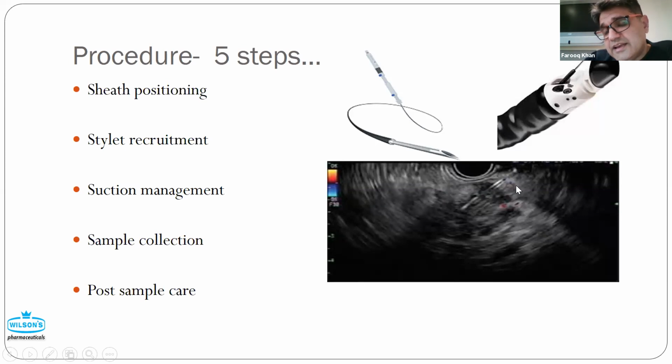Yes, there are fanning techniques, there are different methods, but if this is the lesion that you want to go into, I would encourage you not to stop here. Why? Because my histopathologist tells me that as the tumor grows, the central area becomes rather necrotic, and you haven't really got much of the cancer cells. So really it's from the starting point to the end of the lesion. You can also use other modalities to enhance this, and I'll take you through a case in a minute and how we benefit from this.